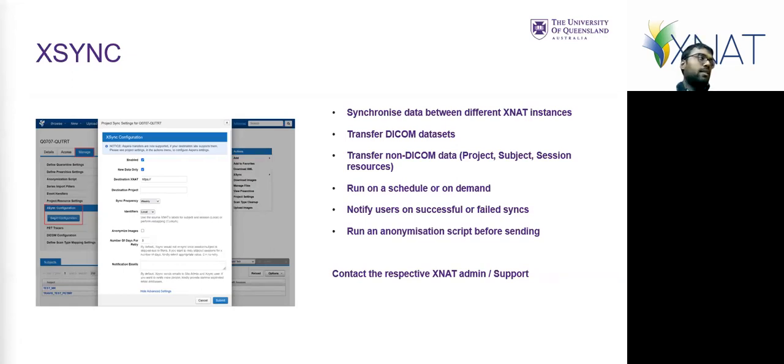We've already had some XSync requests in the past year, and they've all been set up with actually very little issues. It's just let us know if you want to sync from an XNAT to another XNAT, and all AIS XNATs should have XSync.